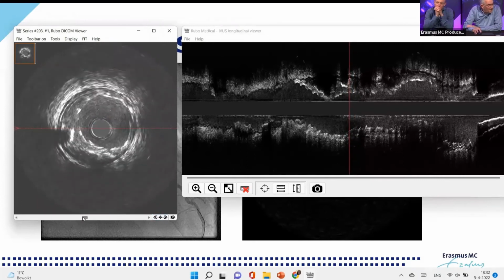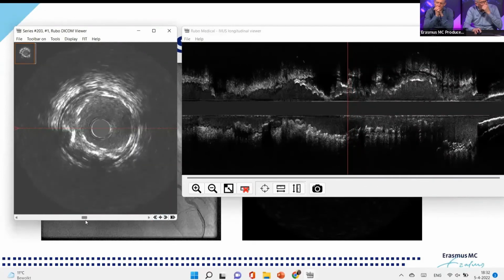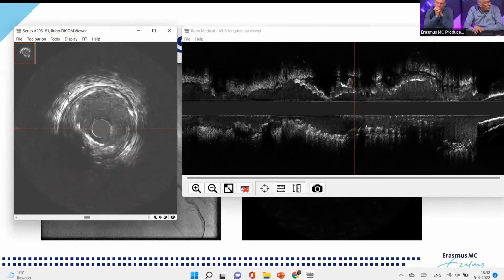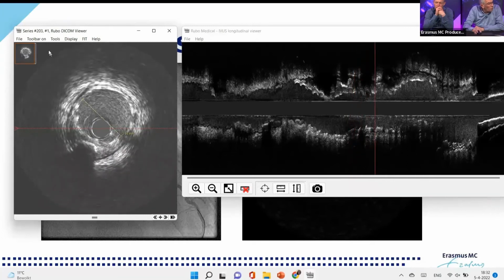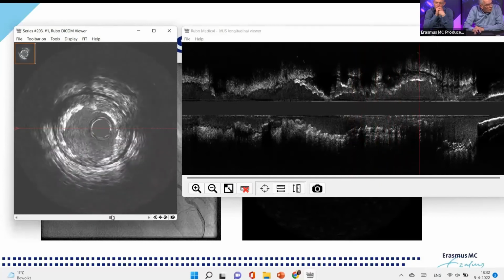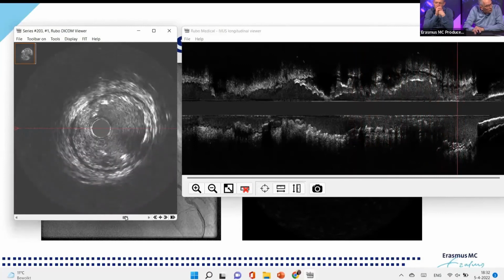So this is interesting. What you see here is this Trio stent, I think it's around Trio. But you see this protruding luminal chunk of calcium here at 8 o'clock. Just in the previous, it's Trio here. You see. So we see in general a good apposition. And here we see at the edge.